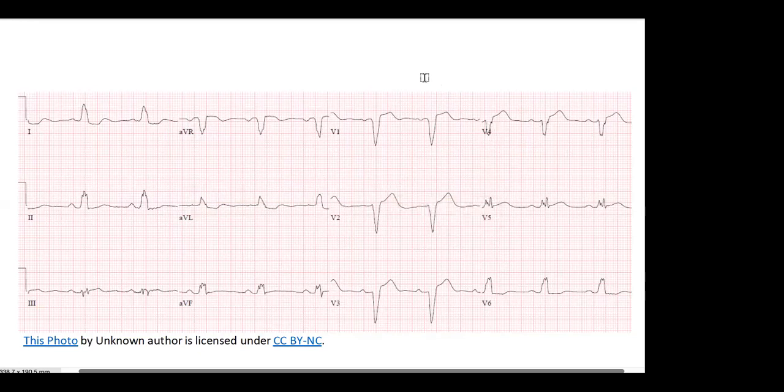So the trick is this: you may end up having a patient who already had his LBBB, gets a heart attack, but you won't be able to see it through an ST elevation because the scars are already built on the left side of the heart. And then you may end up missing the diagnosis.